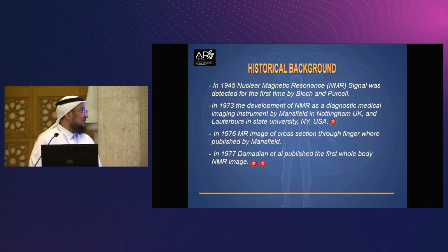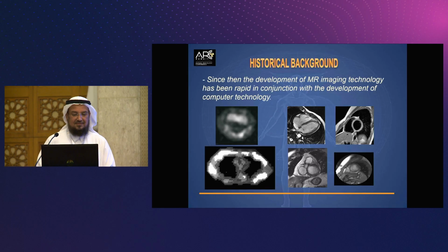So that was the huge magnet, which was like 0.001 Tesla. At that time it was a huge magnet, but today this is called a very, very low magnet. Today we have really huge magnets. We can reach up to 7 Tesla, as we will go through in the session.